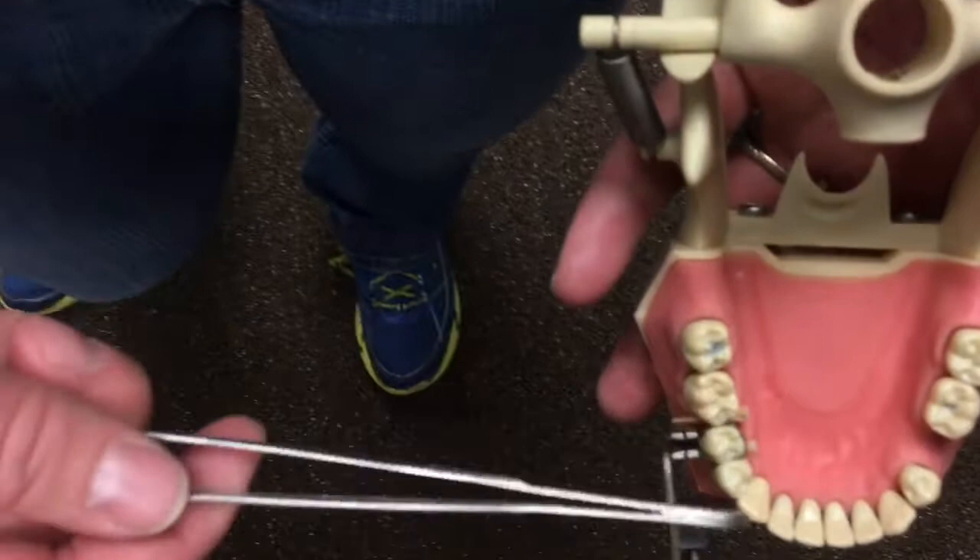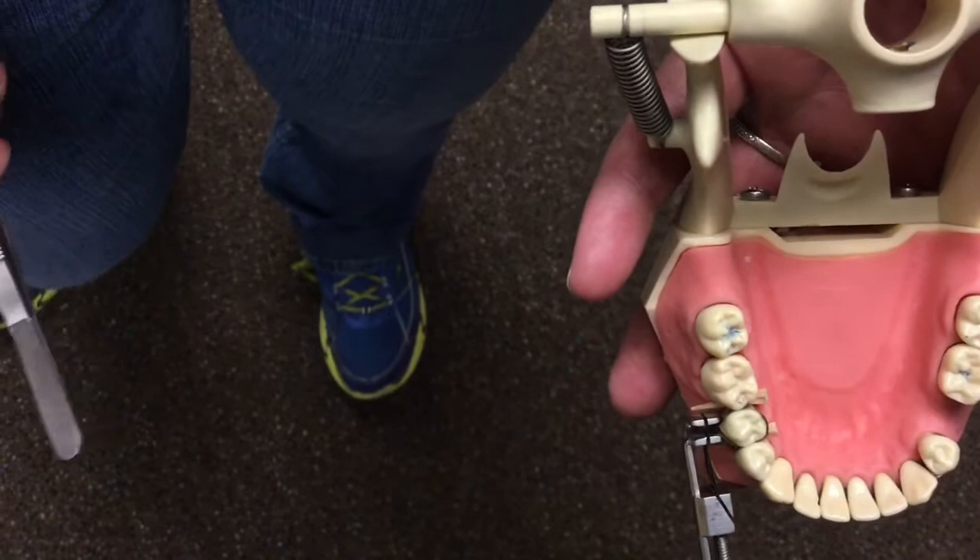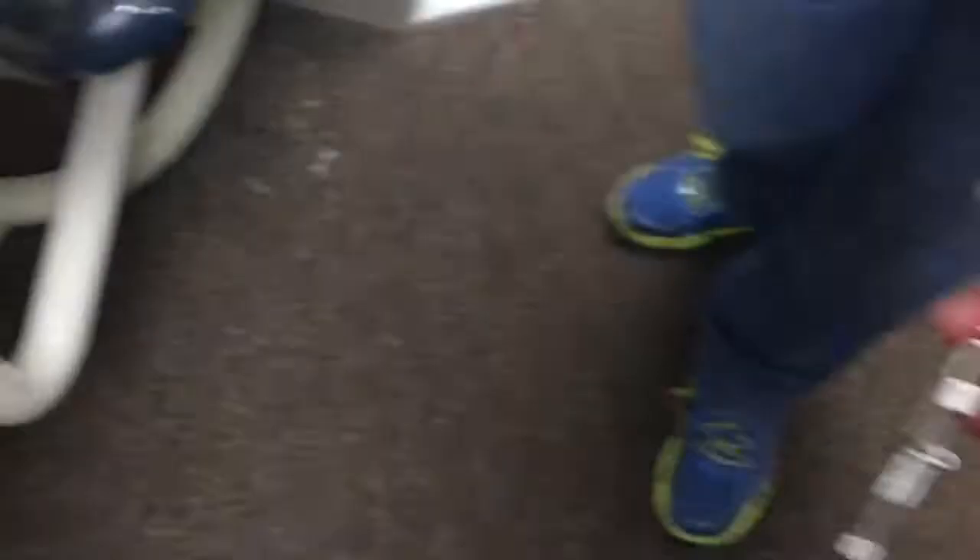That's the only difference between a class two and a class three caries restoration with composite — just adding either the Toffelmire with matrix band or the mylar strip. Everything else on your tray is still going to be the same. As you work with the doctors, you'll get to know exactly what they want, and then you won't have to take out all the stuff, but to begin, this is what you'll want to do.